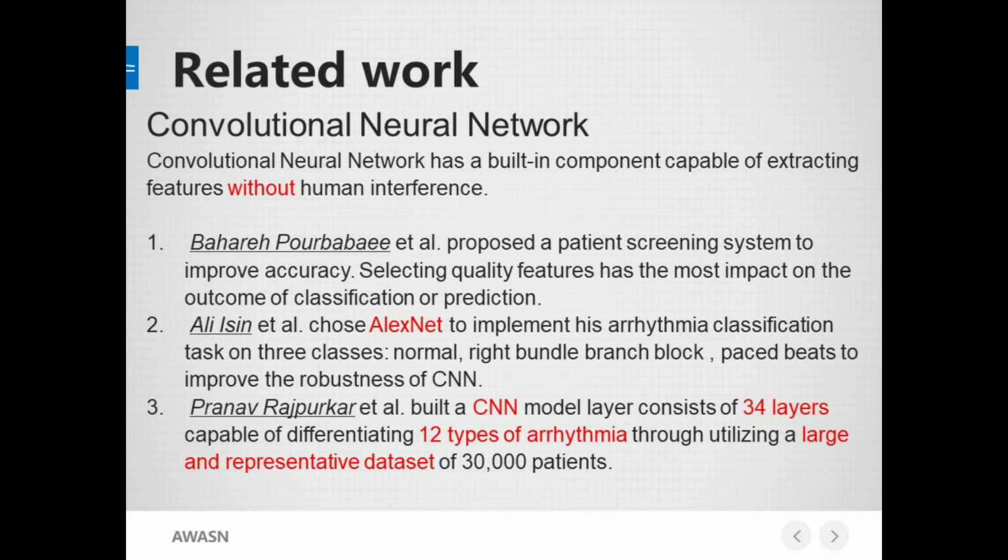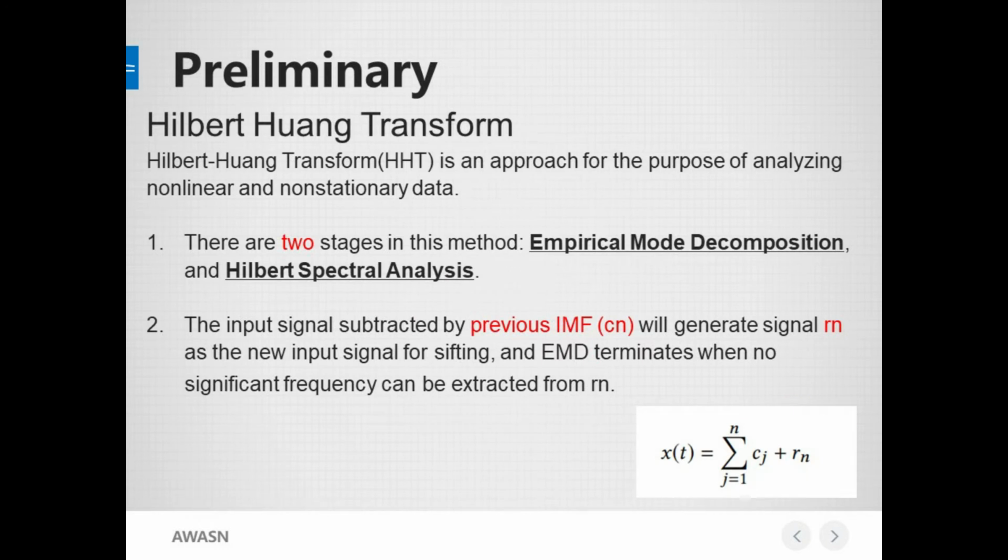This is because information that is useful for analysis may be lost due to the limitation of raw signals that are one-dimensional in nature. As you can see, improving the automation of the feature extraction process and enhancing signal processing techniques is necessary. As I mentioned in the beginning, we use the Hilbert-Huang Transform and CNN method in this work.